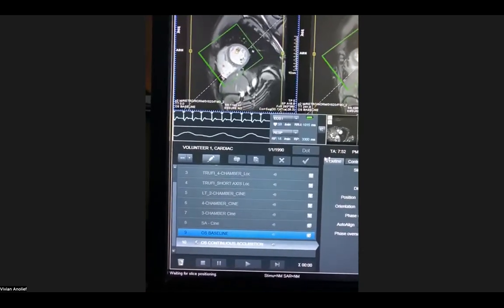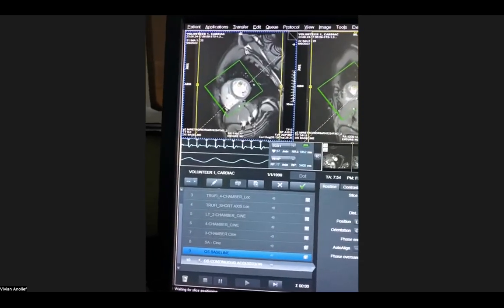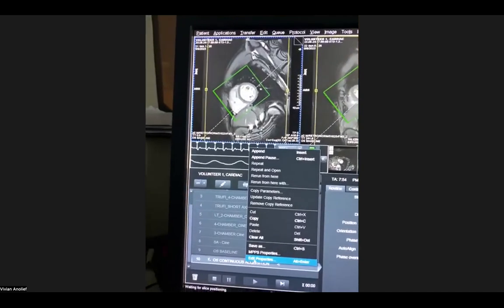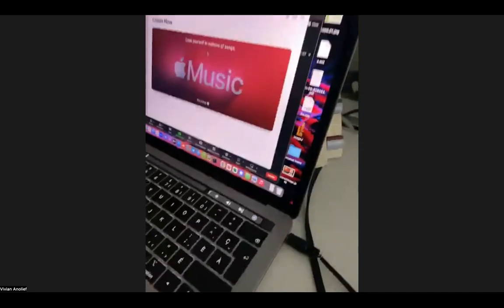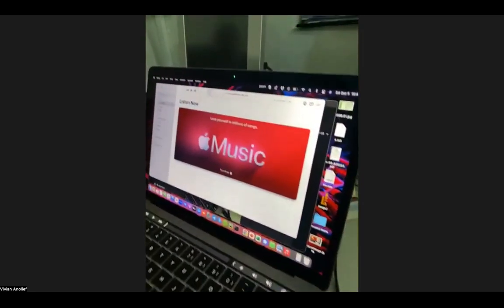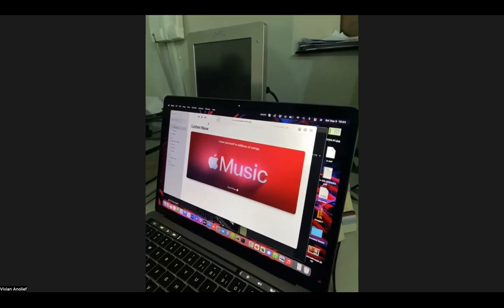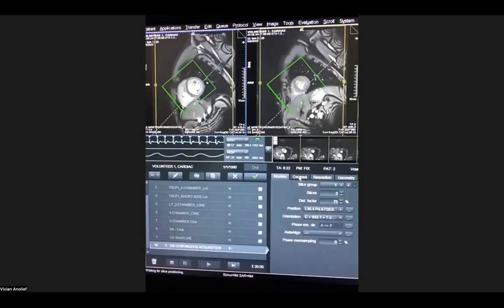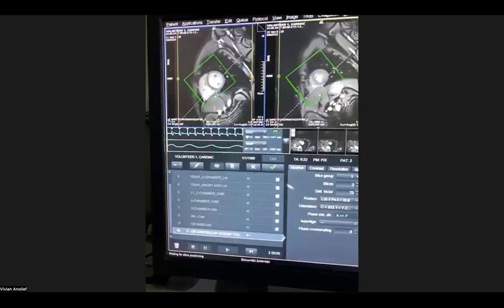And then here, normally we do automated breathing instructions. Here we do manual breathing instructions because I plug into an aux cable. Can you just show that? We plug an aux cable and then we play a recorded acquisition. So Wally's going to do a prep scan, and before he actually acquires the image, he and I are going to start at the same time. We usually do a little countdown. So he's just going to prep the acquisition.